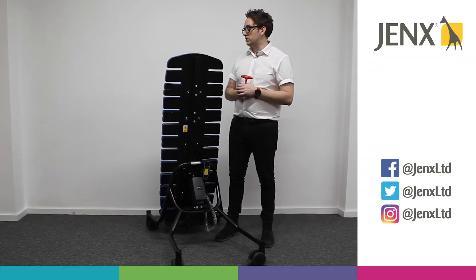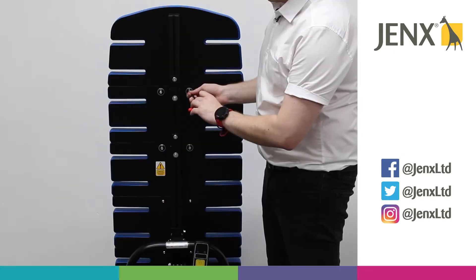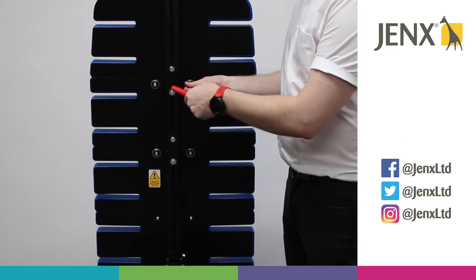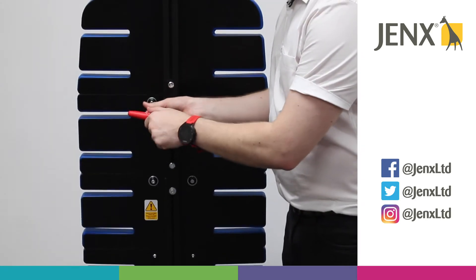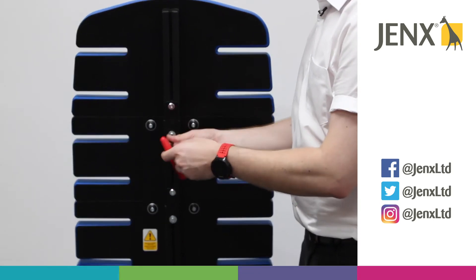To remove two of the support boards, we've got a couple of allen keys here that we need to loosen. Start by loosening the two either side of the column, and then loosen the bottom allen key here.